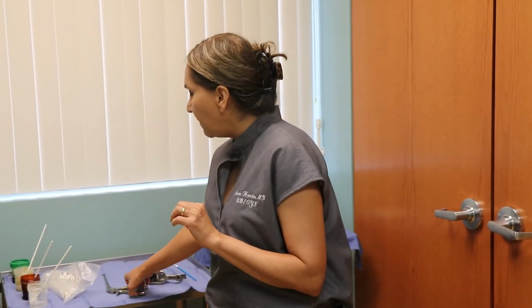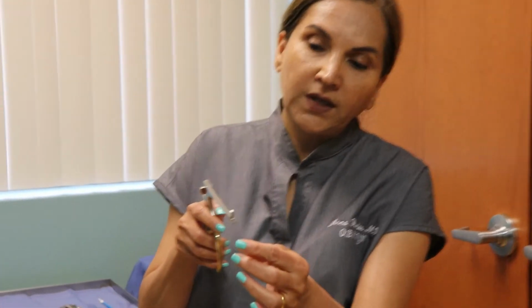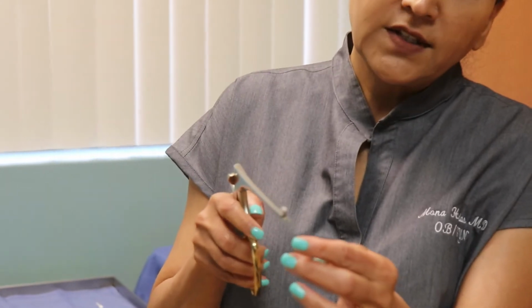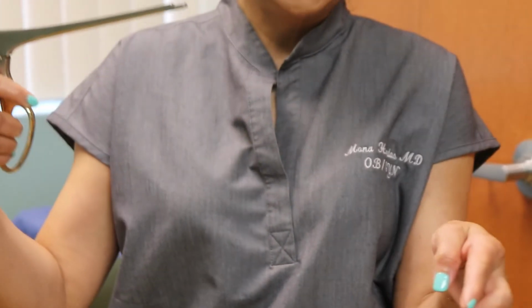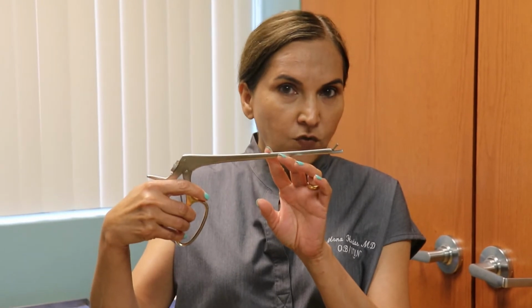So we do a biopsy. Now don't worry about the word biopsy. It's a very microscopic biopsy. So this is the instrument. This is the biopsy instrument. See, it has got these two jaws in there, and it's just going to go and pinch a little bit of your cervix and come out. It's a little pinch, tiny, tiny microscopic biopsy. This is what we use for it.